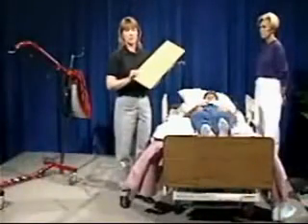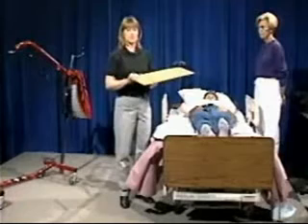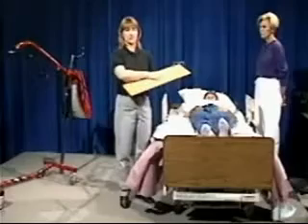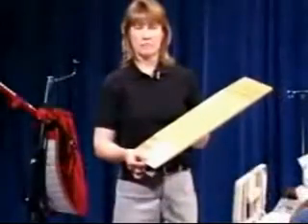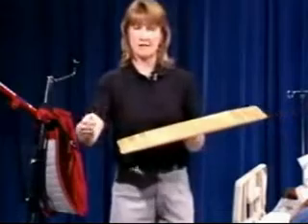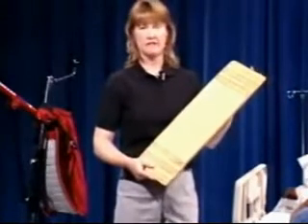What you would do with this, I'm not going to demonstrate for you right now. I will do that in another video. But what you do with this is it's basically bridging the gap for the patient between surfaces, maybe between their bed and a chair, or going back from the chair to the bed. You slide one end of it under one of the patient's buttocks, and then they're helping with the transfer, and they're just sliding across the surface while you use the gait belt and help them to slide across. It can be done very safely and effectively.